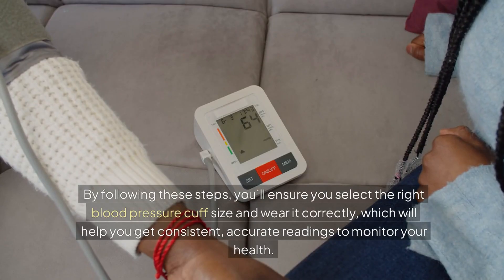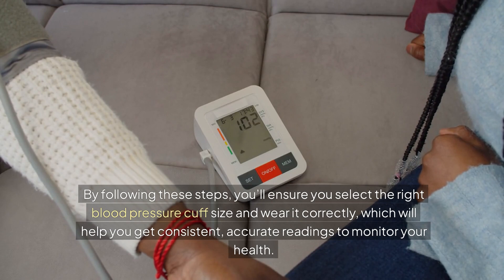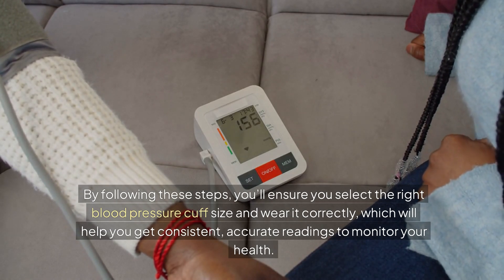By following these steps, you'll ensure you select the right blood pressure cuff size and wear it correctly, which will help you get consistent, accurate readings to monitor your health.